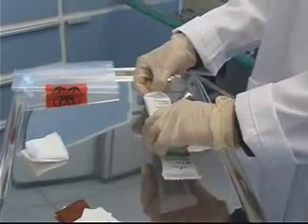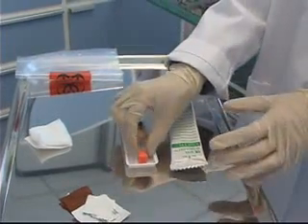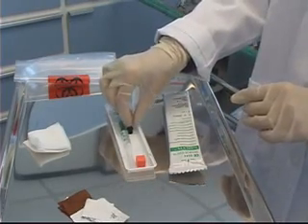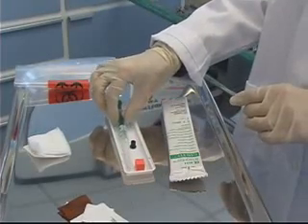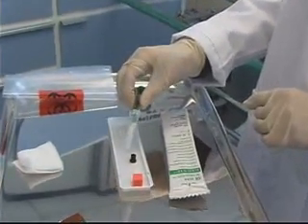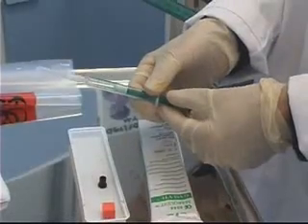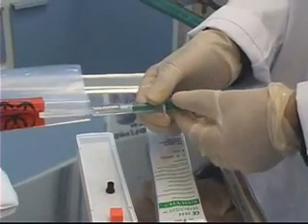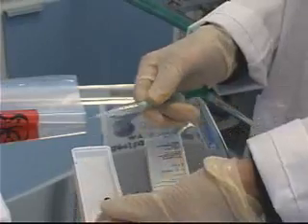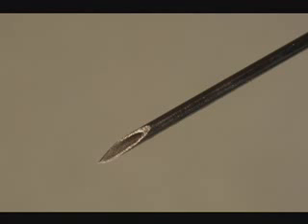While I'm waiting for the skin prep to dry, I can open my blood gas kit. The kit is made up of three different pieces: an orange air ball, which I'm going to use to expel any excess air from the syringe; a black cap to go over the syringe for transport to the lab; and a 3cc heparinized syringe with a needle attached. I'm going to pull back slightly on the plunger so that once I've got the needle in the artery, it will fill the syringe with pulsations from the artery. I'll slide the cap off the needle and confirm I can see the bevel, so I know to go bevel up when I insert the needle through the skin.